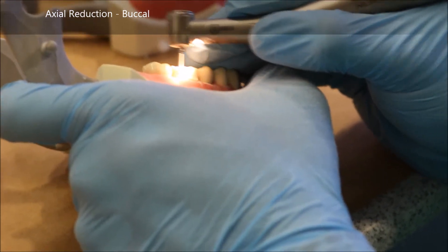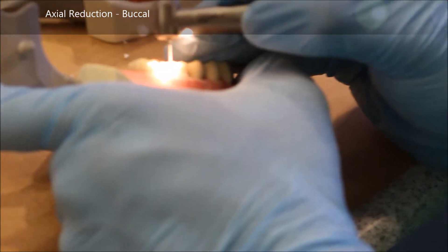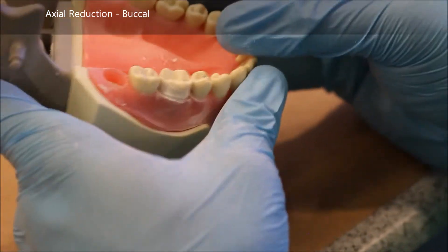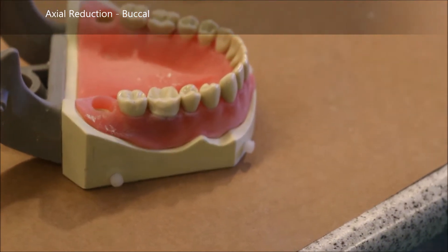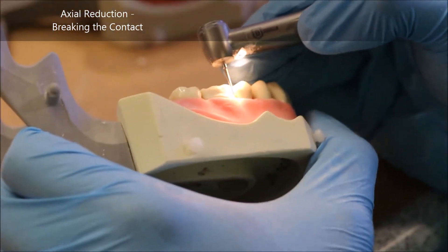With the 878, the goal is to get your chamfer around the buccal and lingual surfaces, but you don't necessarily break the contact with the 878. You take it in as much as possible without nicking the adjacent tooth. There's a better burr in your black burr block that is used to break contact between adjacent teeth in any indirect prep — that's the 850-010. It's just a little bit thinner and ideal for breaking through the contact.